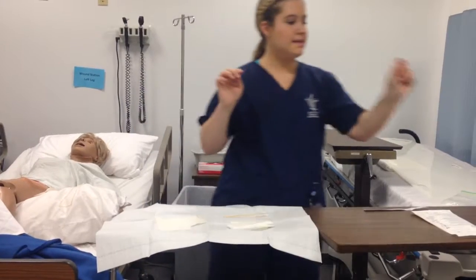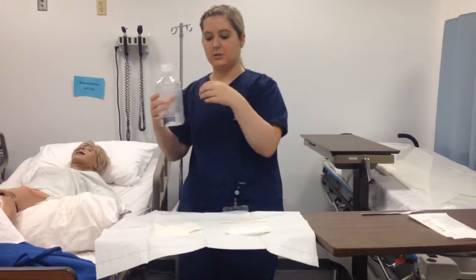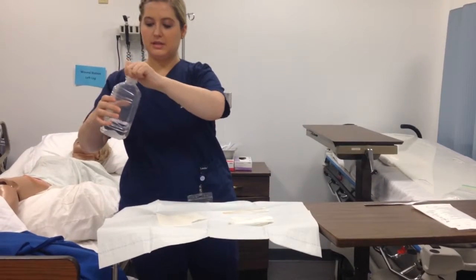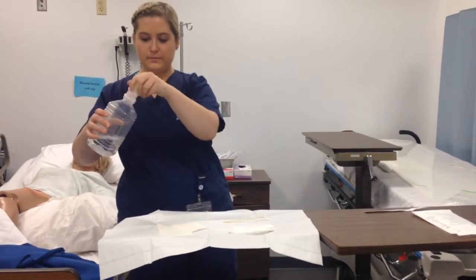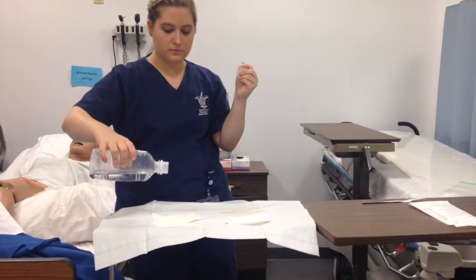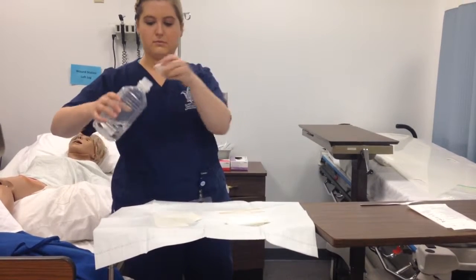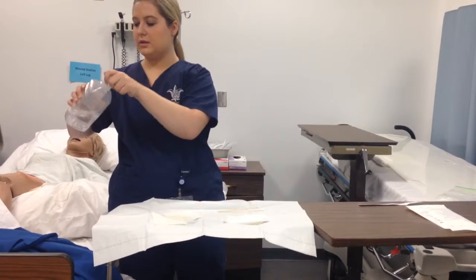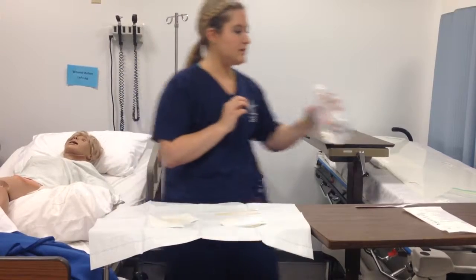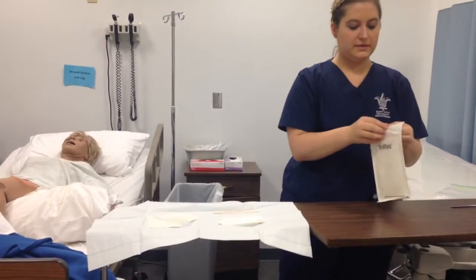Okay, and now I will take the normal saline and put it on my 4x4s, making sure to go around my sterile field and to pour away from the label. And then I would time and date my normal saline. Now I'm going to put on my sterile gloves.